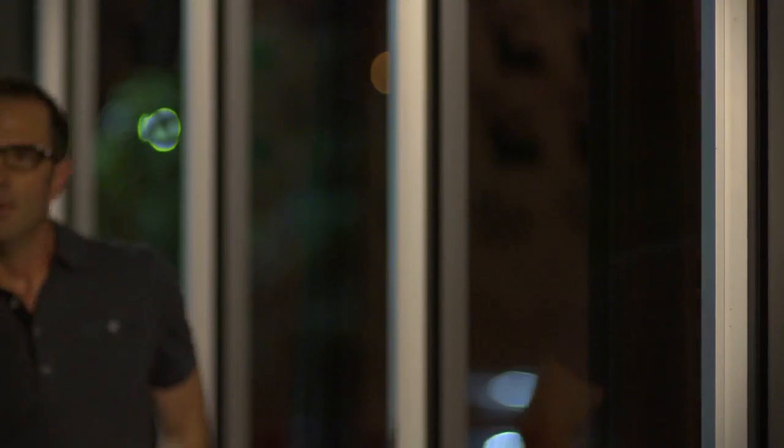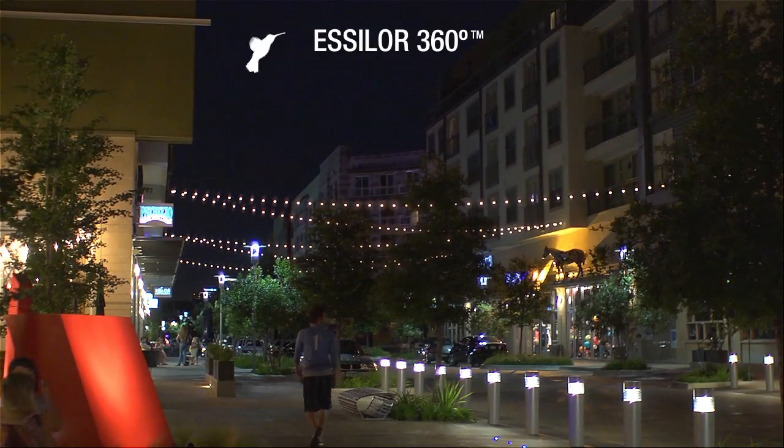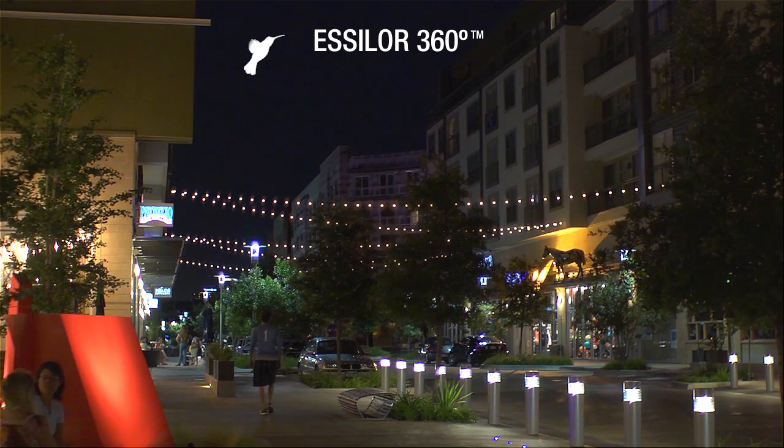With Essilor 360, contrast sensitivity increases by 30% over regular single-vision lenses for clearer, brighter vision and superior sharpness even in low-light conditions.